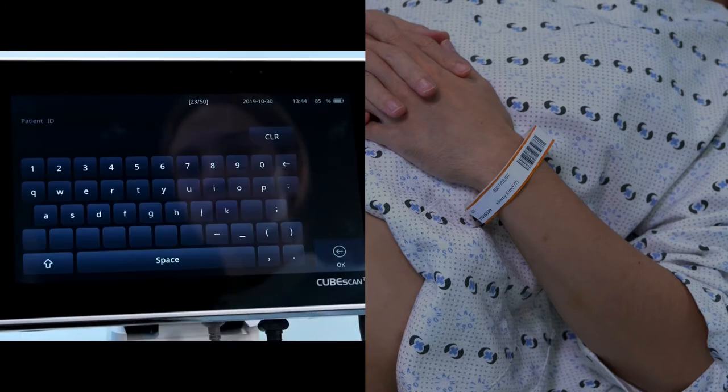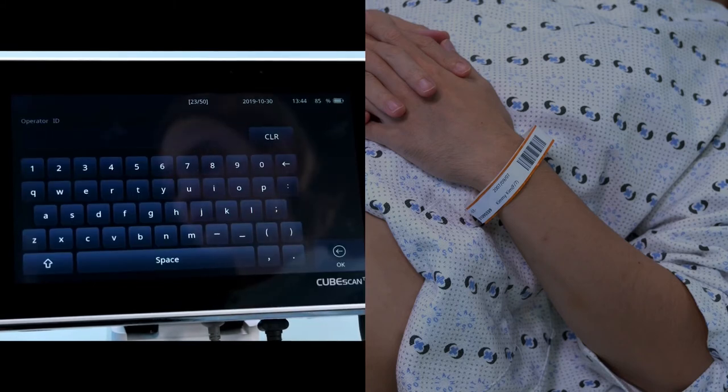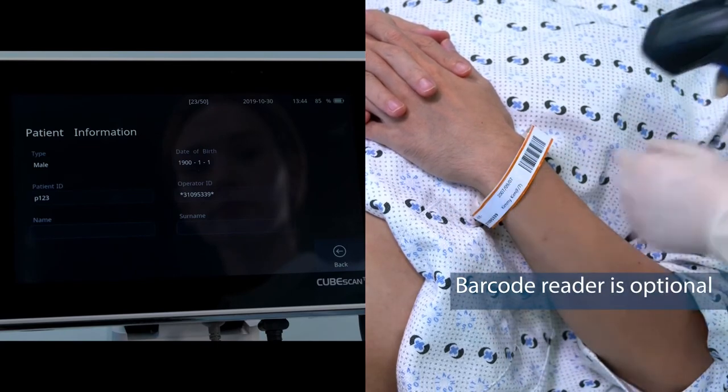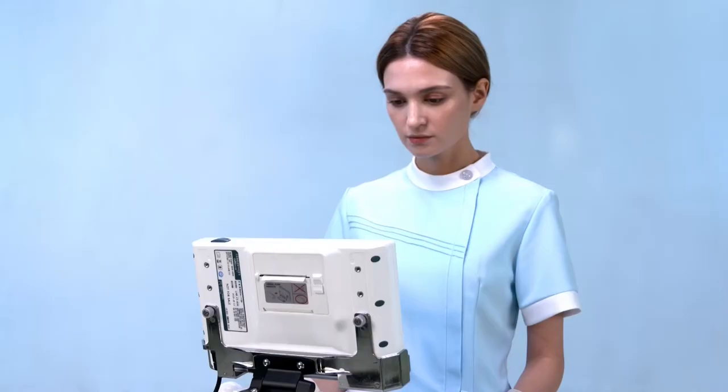Tap the patient info area to enter patient information after scanning. Or simply scan the barcode to save the data. Press the print icon to print out results.